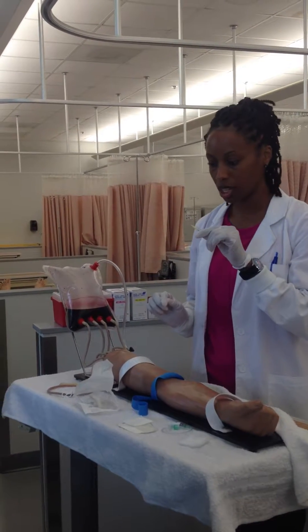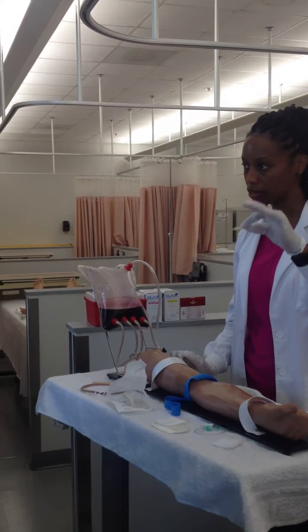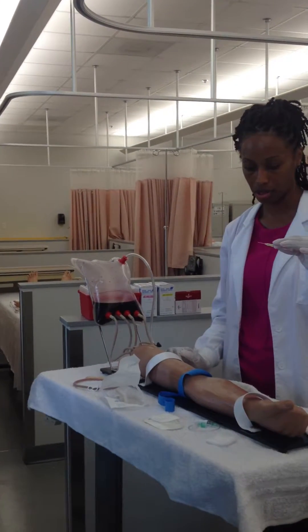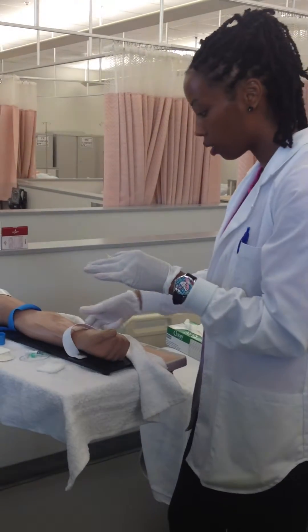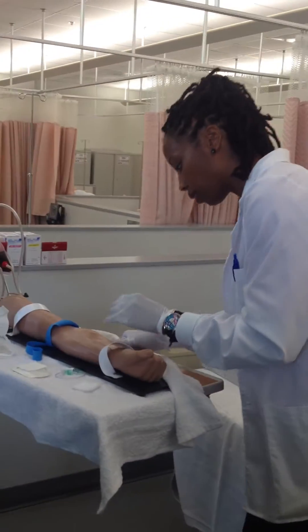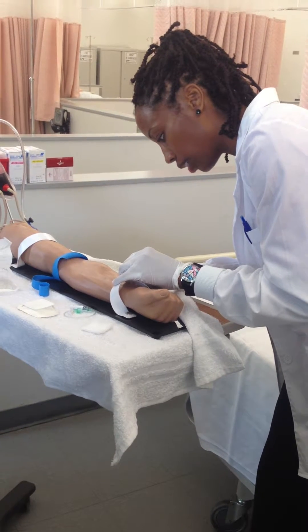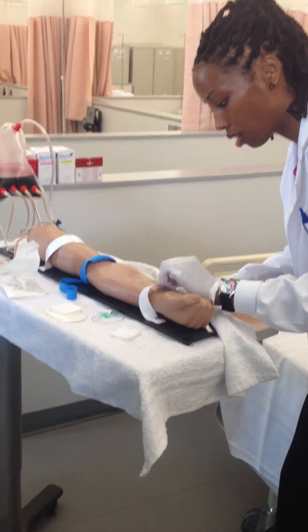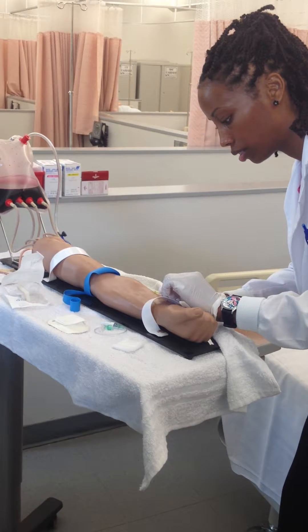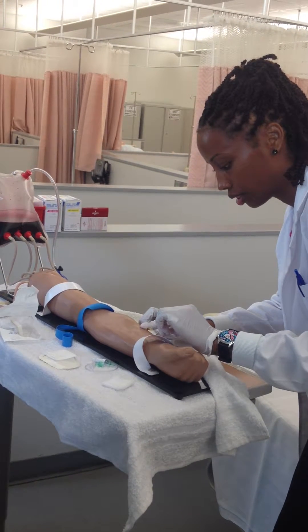Then you check your needle — you want to make sure the bevel side is up, at an angle. You go in at a 15-degree angle or less; you don't go in at a 90-degree angle because then you're going to go in way too deep and that's going to hurt. If it's an elderly patient with a lot of loose skin, you want to hold the skin taut. Then you go at the site and go in. You should see a flash — see that little flash of blood? When you do that, all you do is push the catheter forward. It's a two-hand thing you've got to figure out. Then you hold for blood.